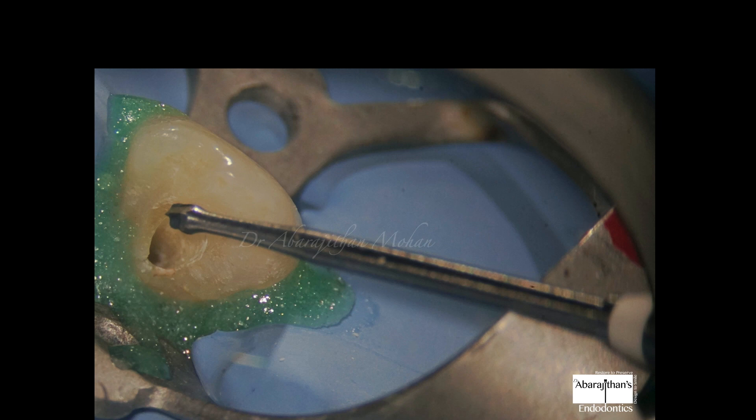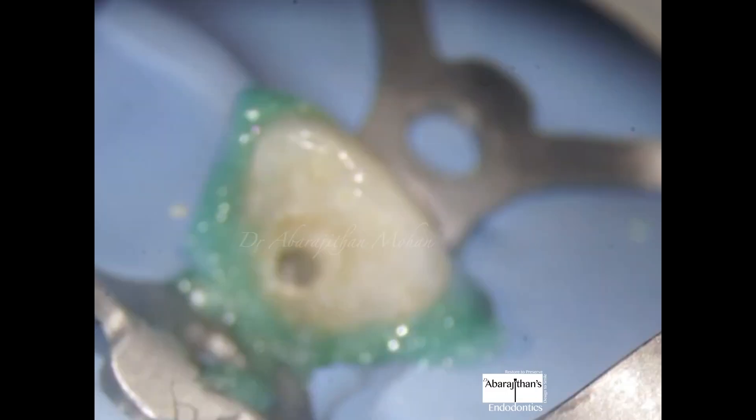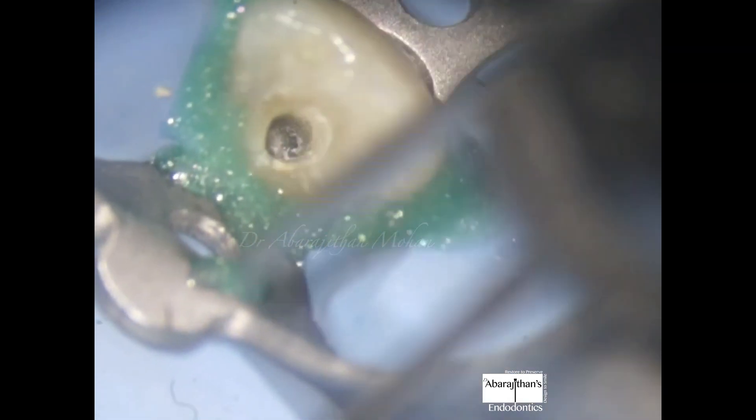An easy tip: you can draw a line from the gingival zenith to the center point of the incisal edge, which tells you the orientation or long axis of the tooth — even after isolation this guides the direction of your drill. We need long-neck round burrs in a slow-speed contra-angle for this. You can see I need to move more distally from the purchase point already achieved, and I'll do it very slowly.